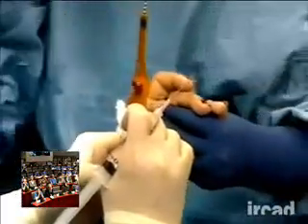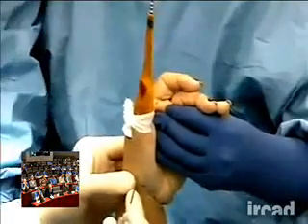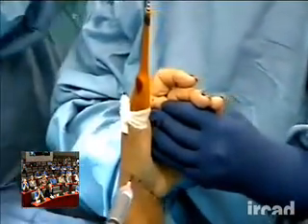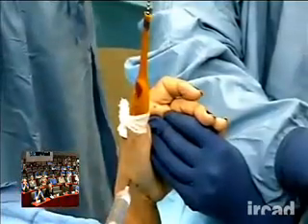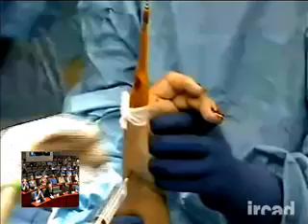Okay, so here is your TM joint. There's a little subluxation. Could you explain to us, Alejandro, how do you find the portals? Marking pen, do you have? The portals are really very easy.